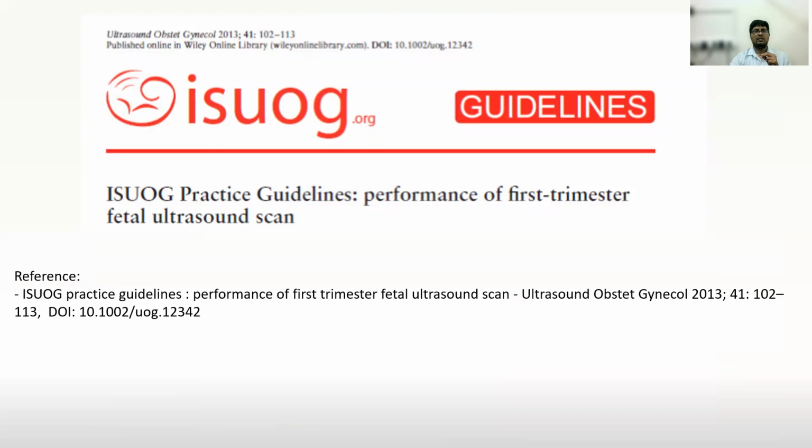All these points have been taken from the ISUOG guidelines, which are available freely on the internet, and it is very well laid out in this PDF format. If you have time, please go through it. It gives you a picture on how to do things and what not to do.